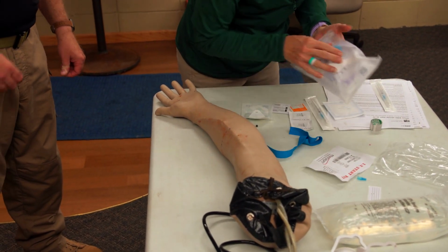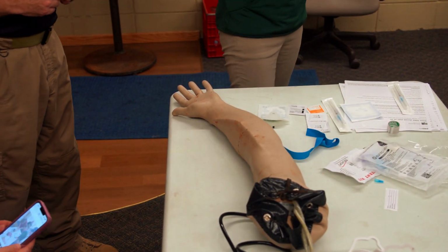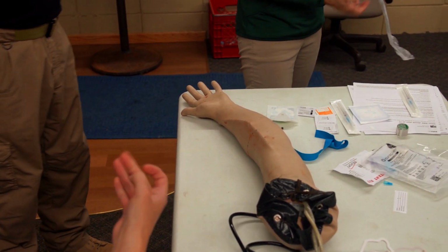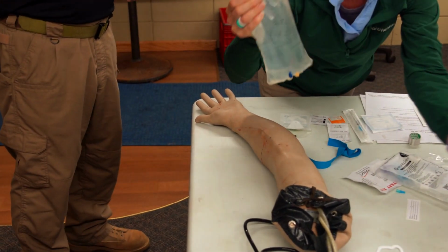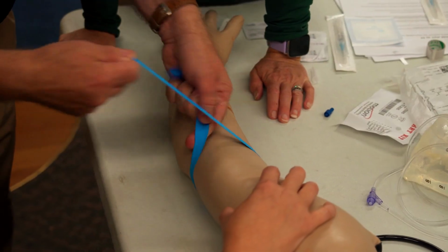Okay, so let's grab your IV. Why don't you grab your bag first, make sure it's ready. What are you looking at? So it's good. The other thing is look at the solution. It should be clear and not cloudy. And so as you take that off, it's easier to see through. So again, it's not yellowed or you see floaties or anything. You don't see any floaties in there. Good, okay, perfect. So something like this.